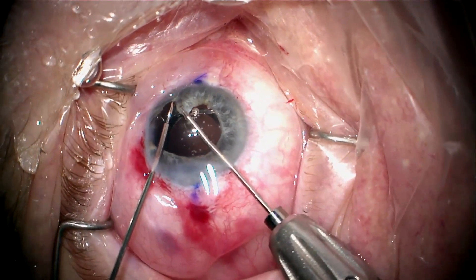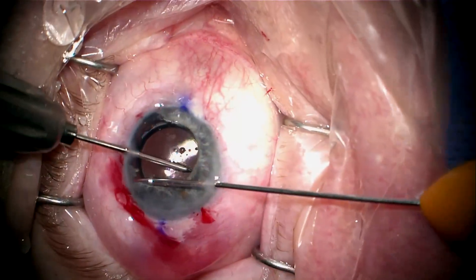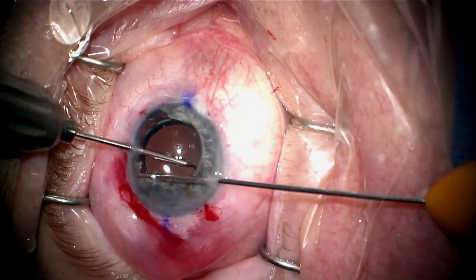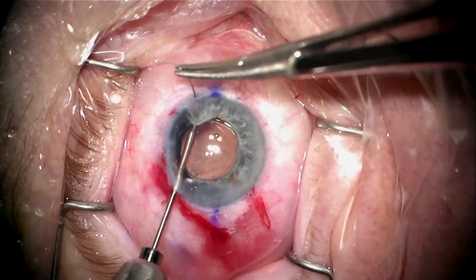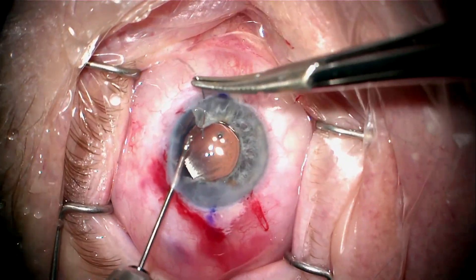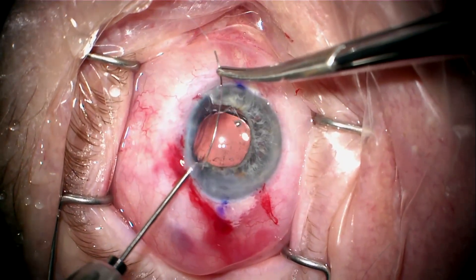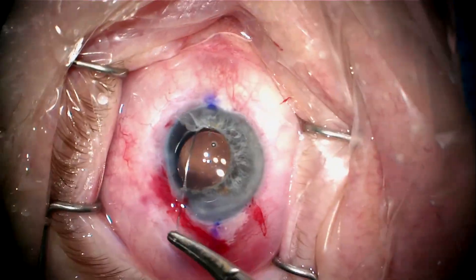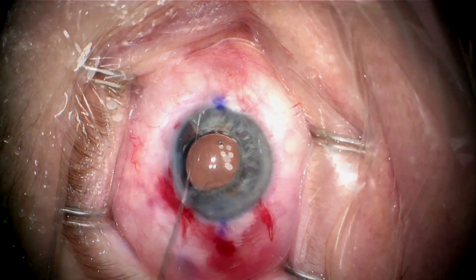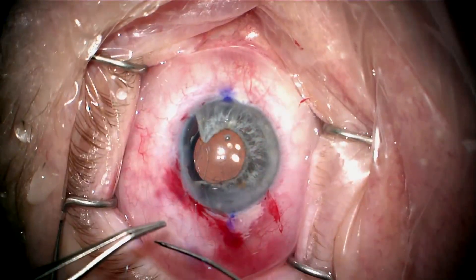What I'm going to do is release the tension by using a microscissor to cut the iris and release the tension right where you see me cutting here. I'm going to bring those two cut flaps together to try to recreate the pupil. I'll pass the suture through each side, bring it out through a paracentesis, loop this end of the suture out, and do a forethrow tie.